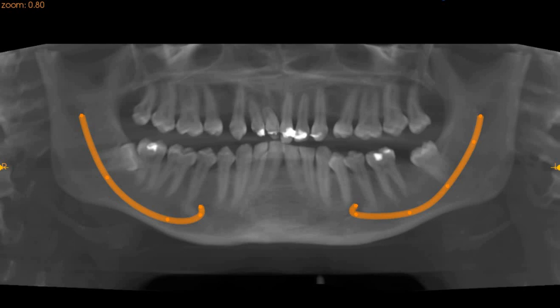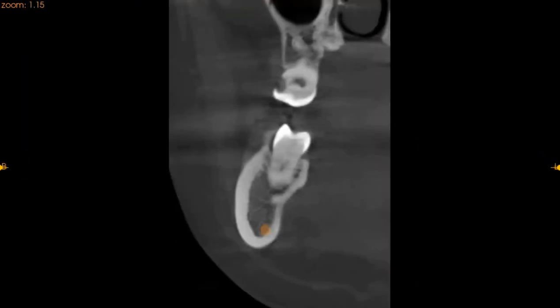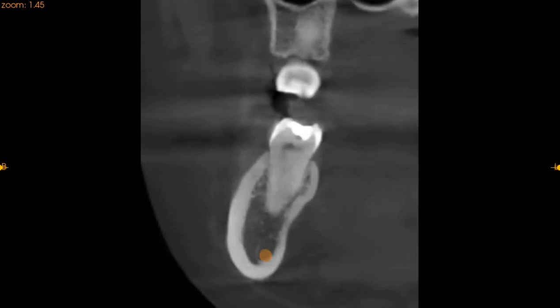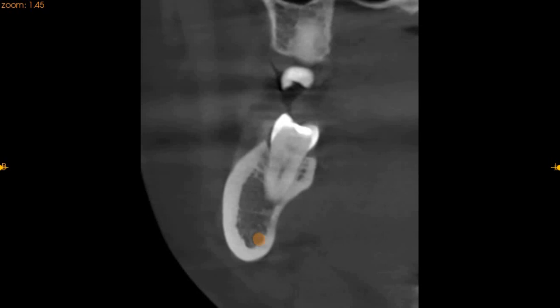Now on the transaxial view — the transaxial view is the proximal view. The proximal view will show you this is 37. As you can see, 37 has a filling restoration which is leaking; it has secondary caries. It is relatively far away from the inferior alveolar nerve and we don't see any major pathologies associated with it.